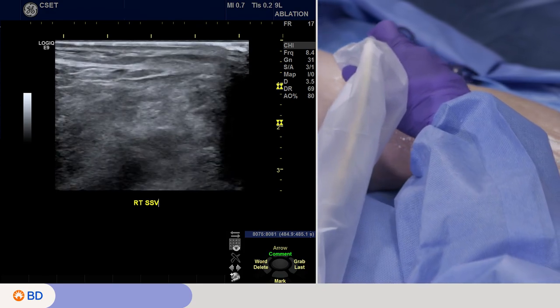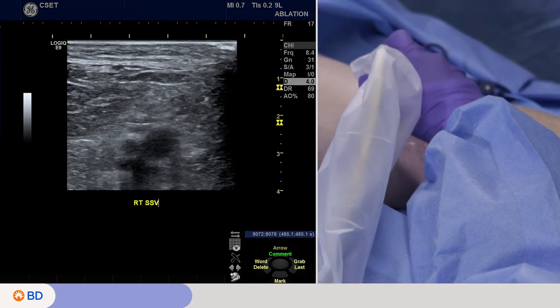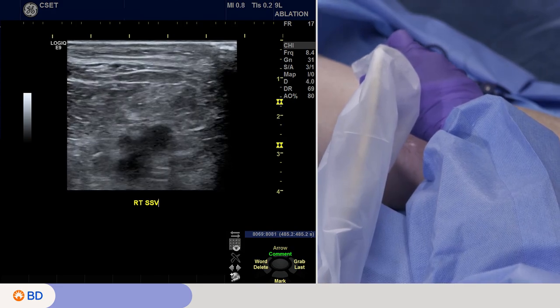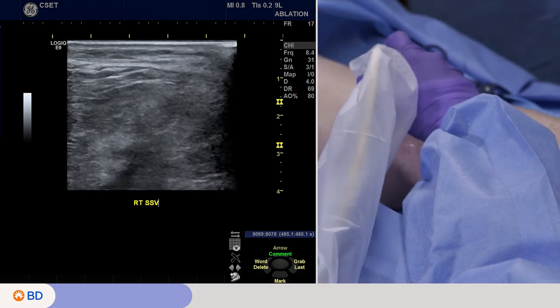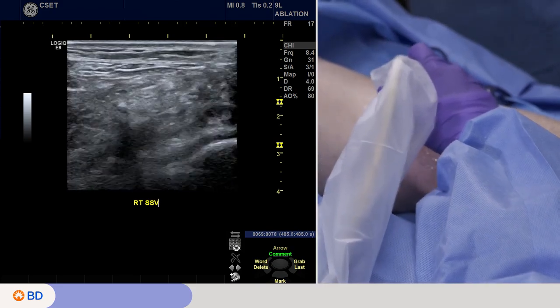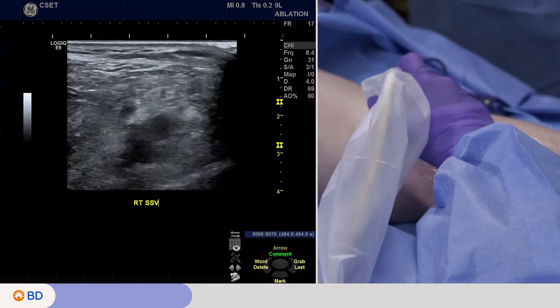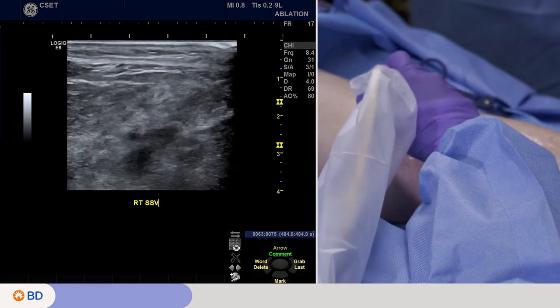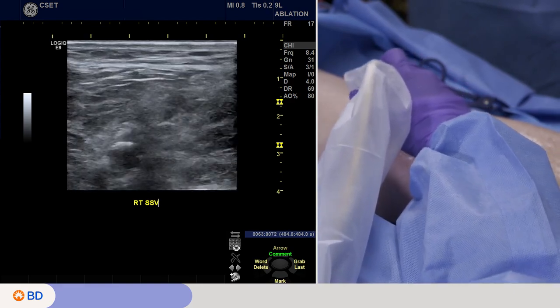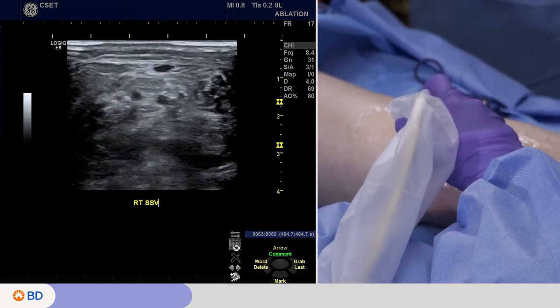We do a quick compression of the deep veins to make sure we don't have any deep vein thromboses. You can see the popliteal vein that she's compressing midway through the ultrasound — it compresses nicely. So there's no indication of a fresh interval thrombus.